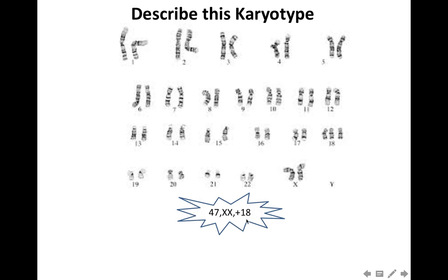This is how the karyotype is described. So this is a case of Edwards syndrome in a girl.